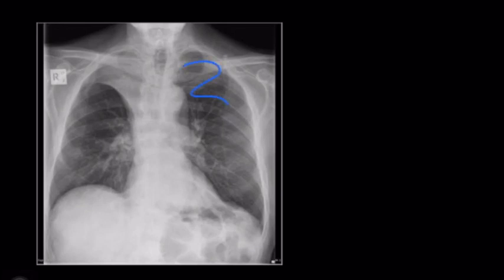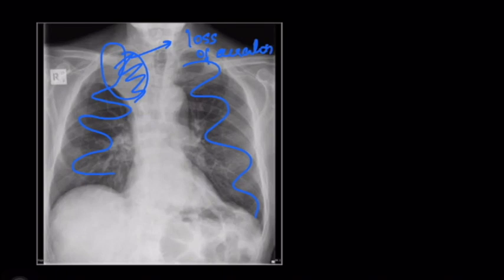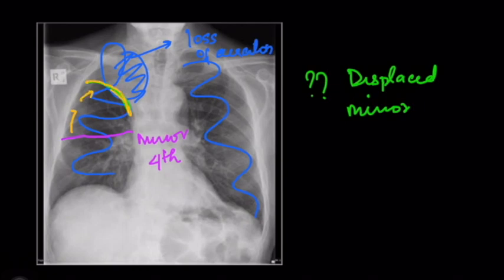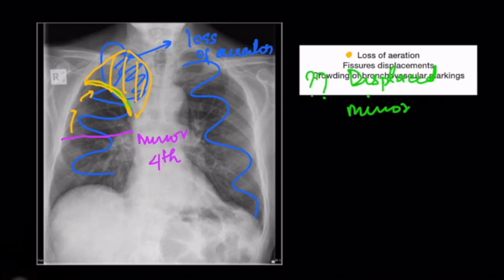In the next figure there is an opacity with a sharp border, which is the displaced minor fissure. This demonstrates the importance of knowing fissures in the radiograph. The minor fissure is normally expected in a horizontal position at around the level of the fourth rib. Here the fissure has moved upward and bordered the collapsed lung. This is the second direct sign of collapse — fissure displacement. We have now seen loss of aeration and fissure displacement.